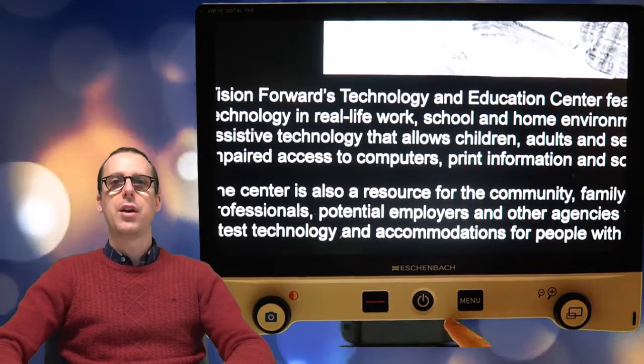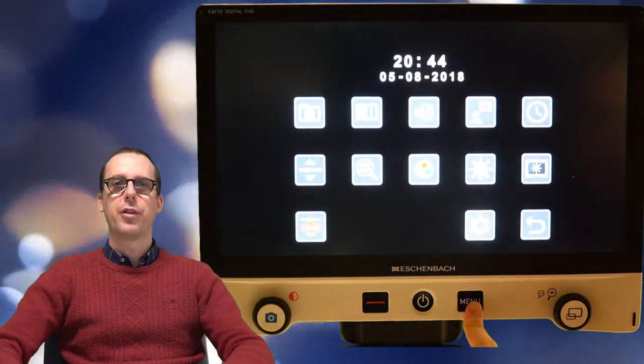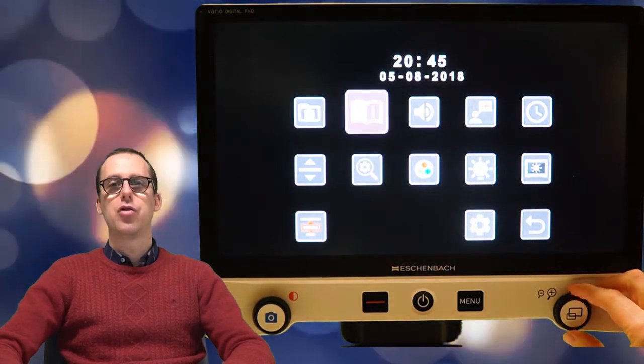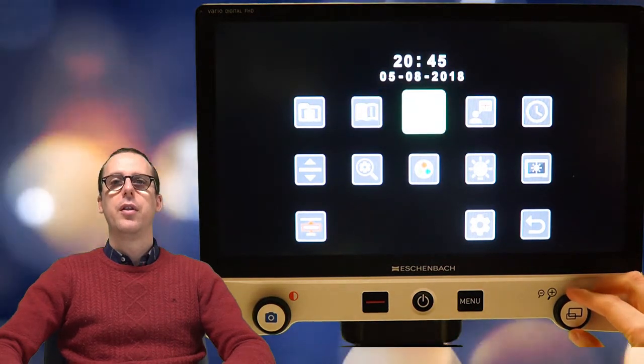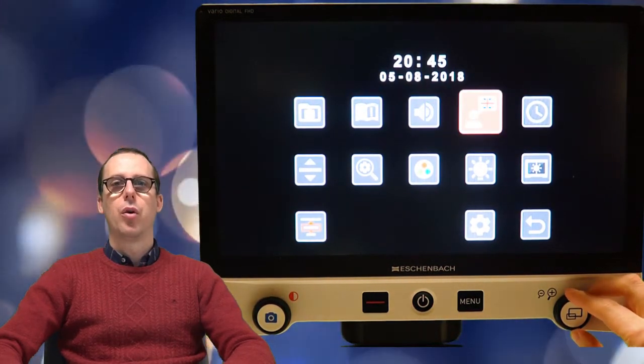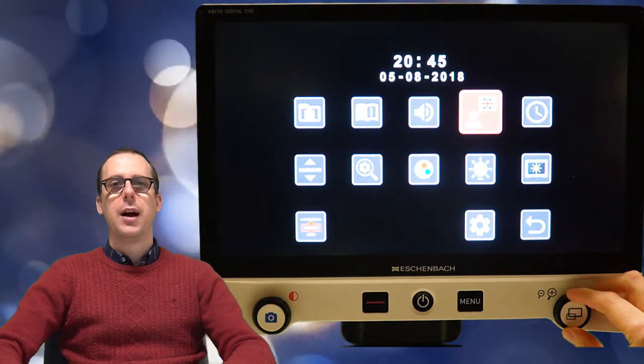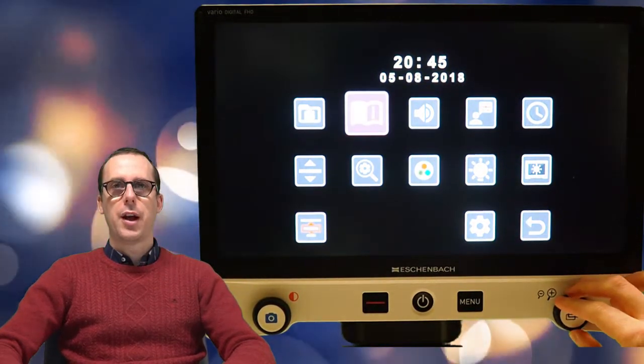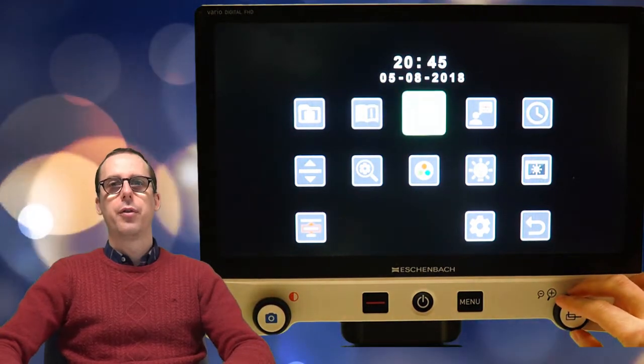Now, the other button is our menu button, and that's going to take us, unsurprisingly, into our menu. Those are fully voiced, which is a really nice feature. So as you're navigating the menu, the device will read aloud all of those menu items to you. And you can even choose the voice that you want it to use. So that's definitely a nice feature to have. And in the menu is all the stuff that you would expect.